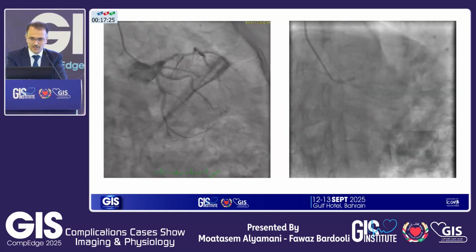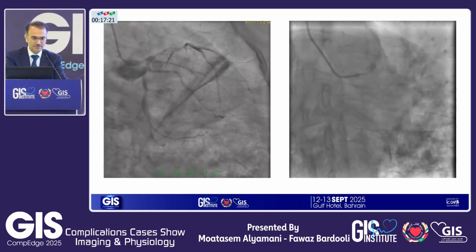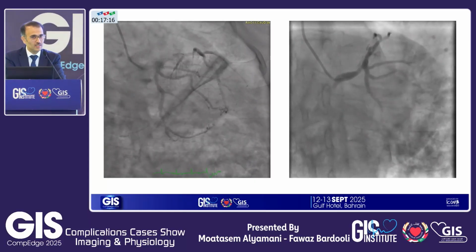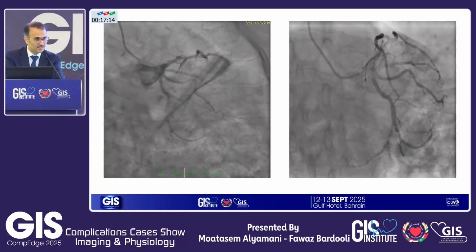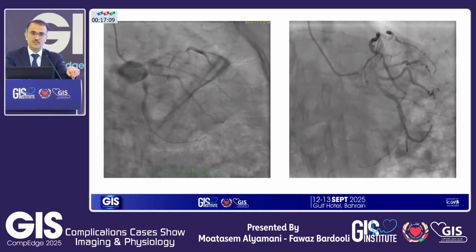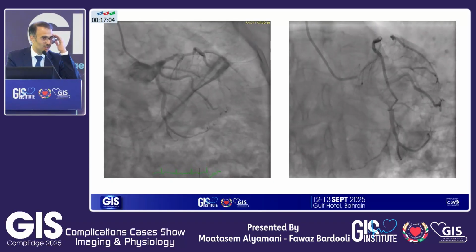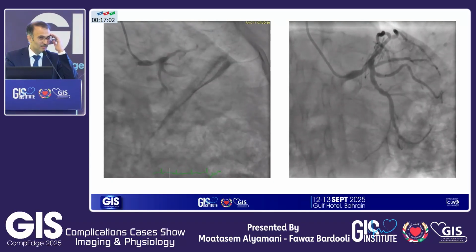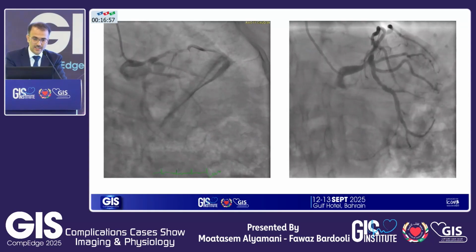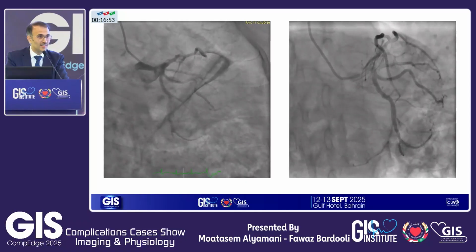So again, you have the caudal views. You've seen, again, the distal left main. I would call it 40%. I show this to Moatasem. Moatasem says, oh, I don't know, this looks like 60%. And again, back to the earlier stage, it depends on my cognitive. If I come with an idea that I want to fix left main today, I'm in the mode, I'm gonna go and fix the left main. If I feel no, the LAD is causing the disease, I'm gonna go more towards the LAD. Am I right? So anything else you want?